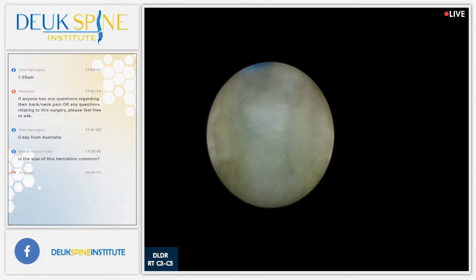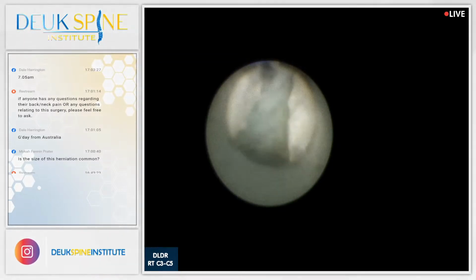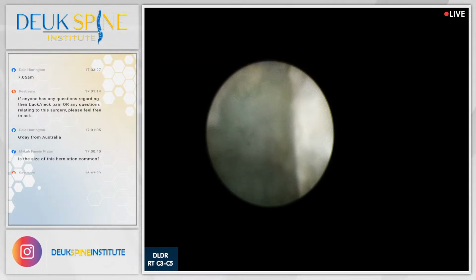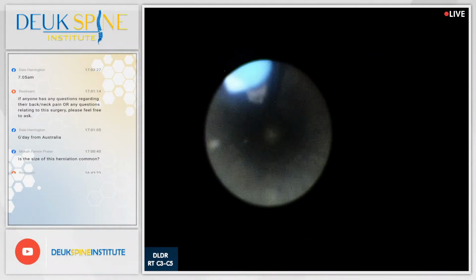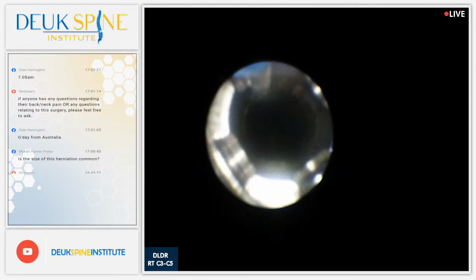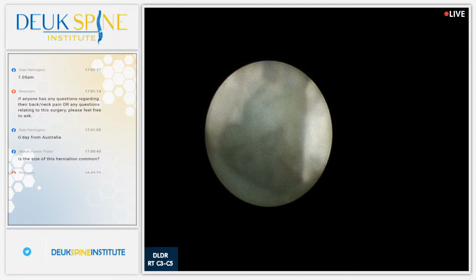what do we got here? That's interesting. I got to figure that out. Not sure. That may be a piece of herniation there. Big piece of herniation. Number three, we're not putting metal in his neck. All right? We don't use metal. We don't do fusion. It's all natural. We're basically cleaning up the herniation and tear, letting his body do the rest to heal it. Okay?